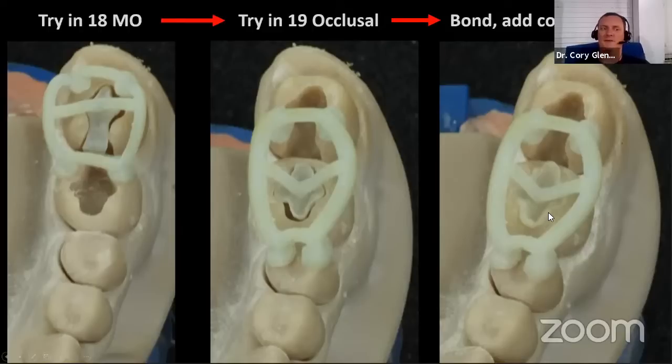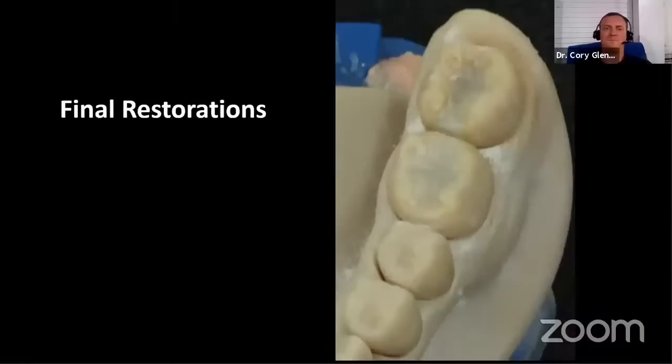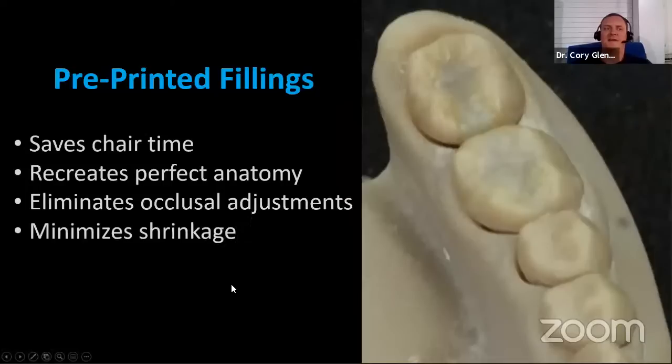And the result is that you've got less shrinkage contraction because it's mostly pre-cured. It's just a thin lining all around it that is being cured in the paste form. Okay. And that's the final restorations. Again, I don't have the side-by-side of their pre-op, but it's identical to this because it was their pre-op anatomy. We just reprinted it. So I thought that was an interesting idea. It saves some chair time.